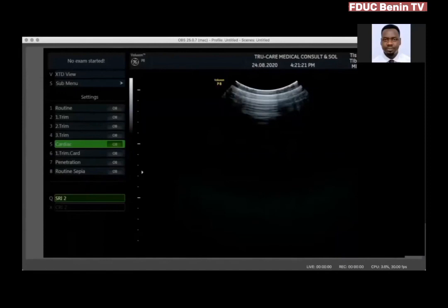And then it's important to note too that there are different machines. So just note that his machine has a lot of software inside. Some people may have the same type of machine and say, why is it that mine cannot do that? The OmniView, you need to get the software for that. And then there are some in which you can invert the acquisition line. So if you don't have that software, you can only look at it from one direction. There are others in which even if the baby is facing down, you can take it downwards and look at the baby from there. So don't get discouraged if your machine doesn't do it. It's just the software, and some of these things cut into that, so you may not need to spend so much money on it.